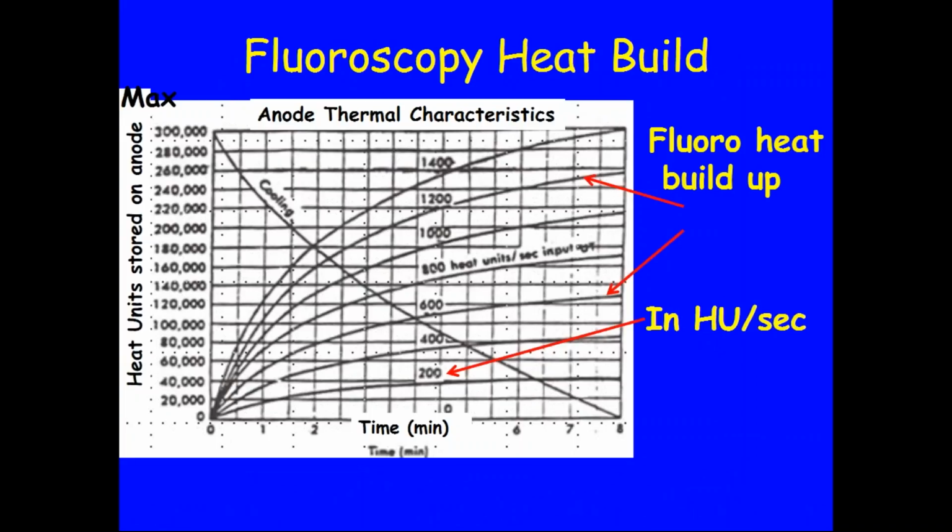And now the final curves that you see on these charts is your fluoroscopy buildup. Okay, we have to address fluoroscopy. You know that you press the pedal and you see an image, but as your foot stays on the pedal, it builds up heat. This is what these curves represent, the ones that start at 0 and build up. They're the fluoro build-up curves. And they tell you, as you step on the pedal with time, how does the energy build up? How do the heat units build up at the anode?